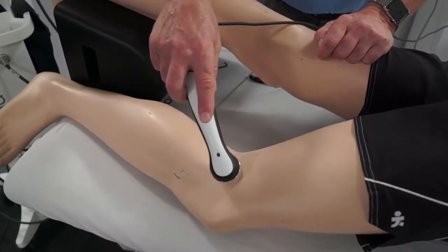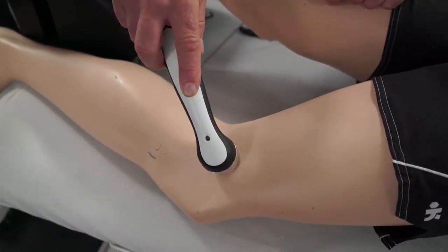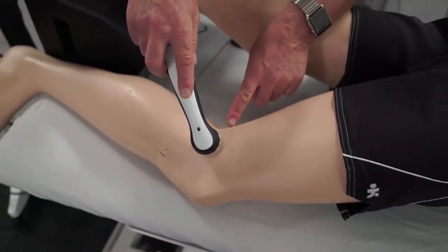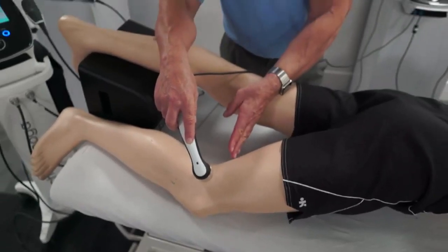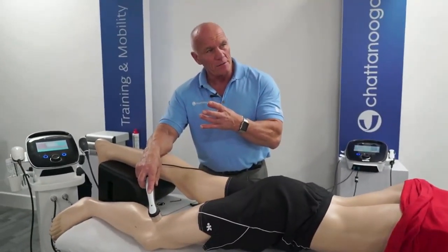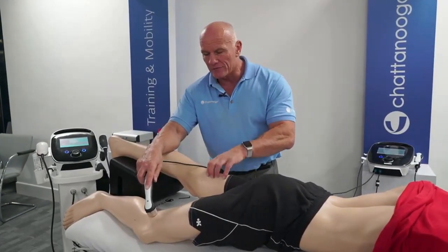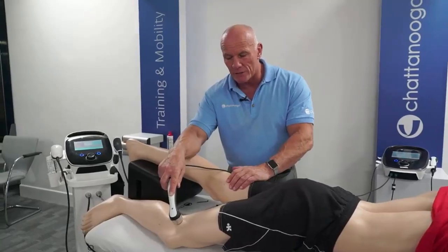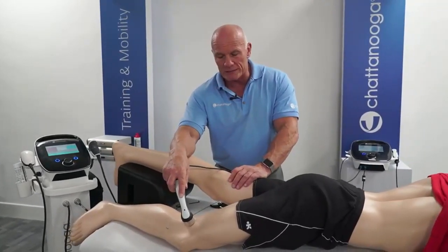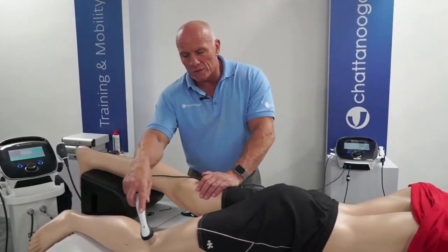But standing waves can occur when sound waves travelling into the tissue hit a tissue interface and bounce back, and then they interfere with the sound waves coming down. They can cause cellular damage. So if I was just to keep it still, I could potentially cause cell damage. So that's it: small oscillatory circles staying over the area that you want to treat.